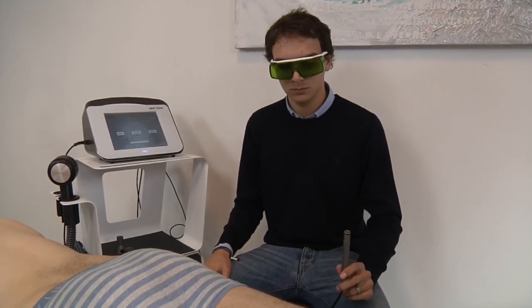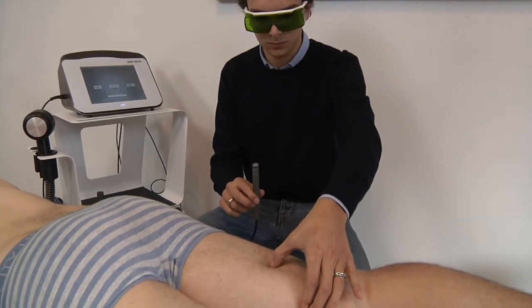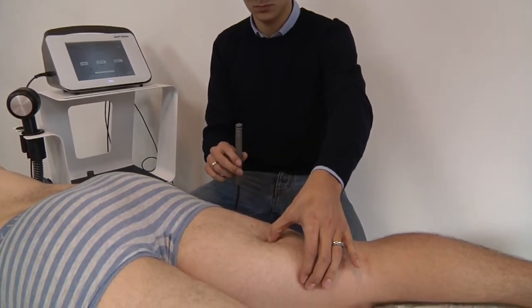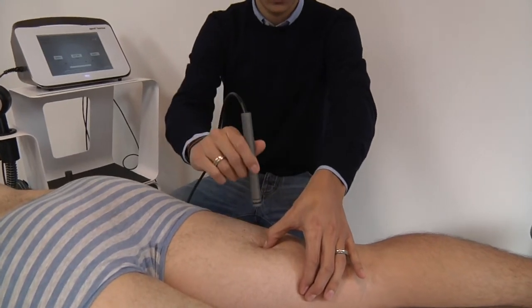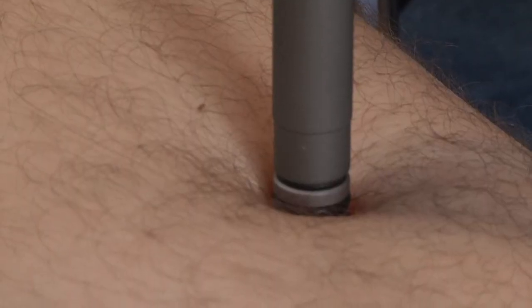We localize the point of the Valiax in the midpoint of the thigh. We apply the pointer with extreme compression on the skin, leaving it fixed, and we start the treatment.